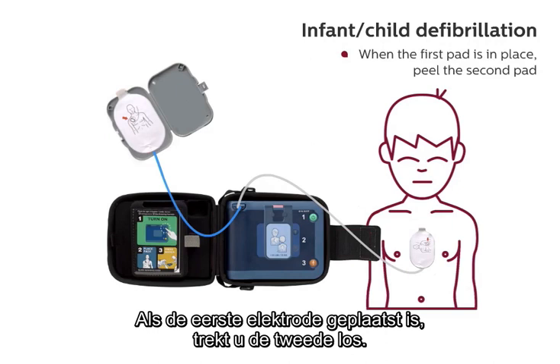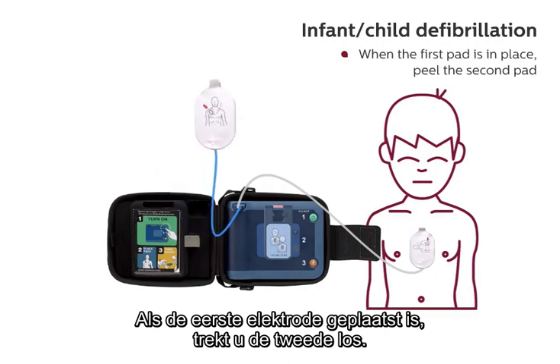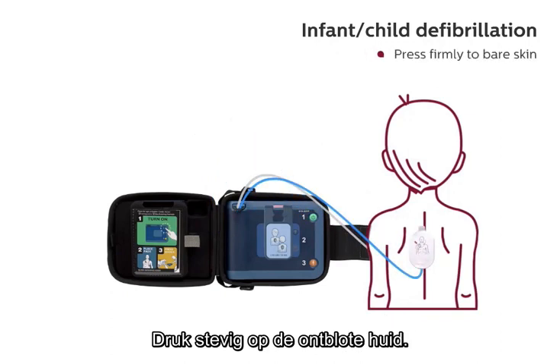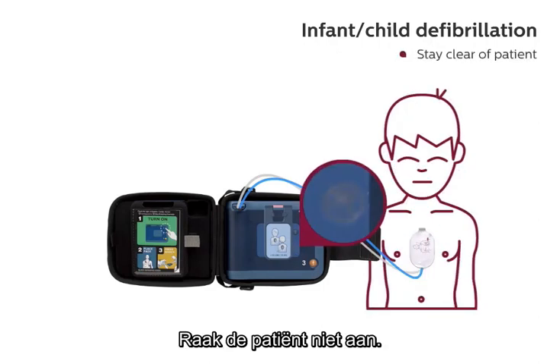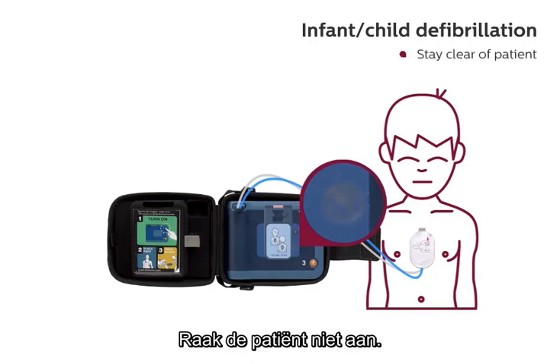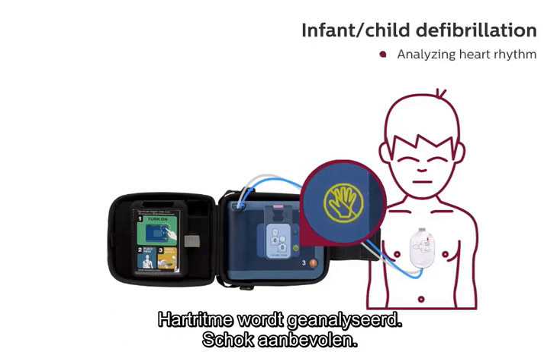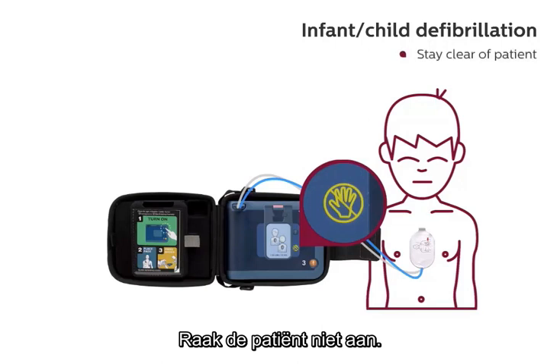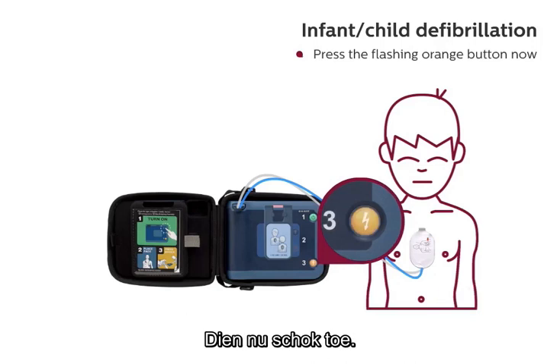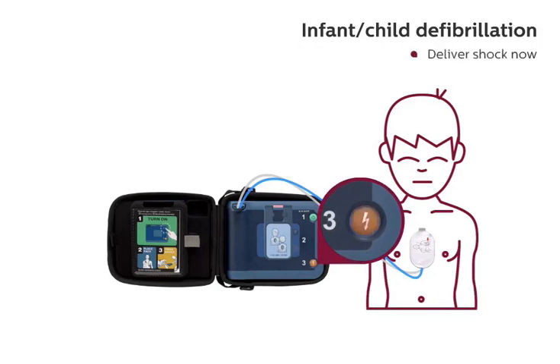When the first pad is in place, peel the second pad. Place pad on child's back. Press firmly to bare skin. Stay clear of patient. Analyzing heart rhythm. Stay clear of patient. Analyzing heart rhythm. Shock advised. Stay clear of patient. Press the flashing orange button now. Deliver shock now. Shock delivered.